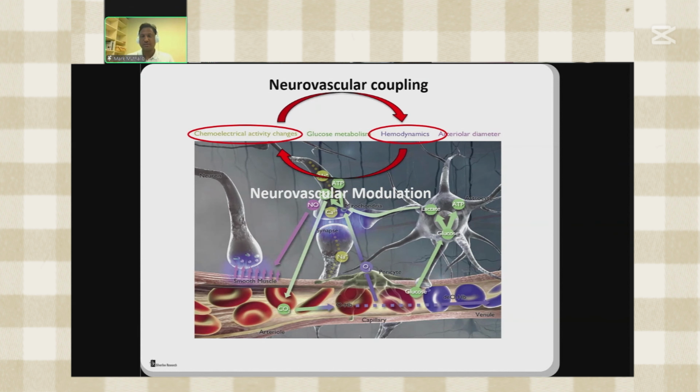So this is quite a different way to consider how the stimulation is actually working, and NIRS is perfectly positioned as a direct measurement of this neurovascular modulation. So before it was a secondary aspect, but now we can use the NIRS signal as a measurement of the effects of stimulation.